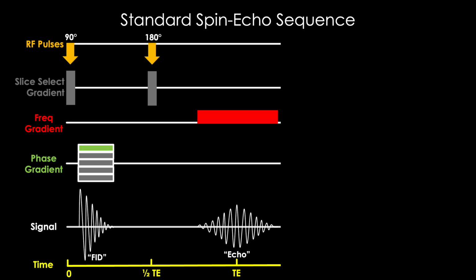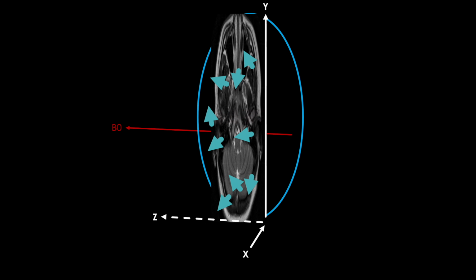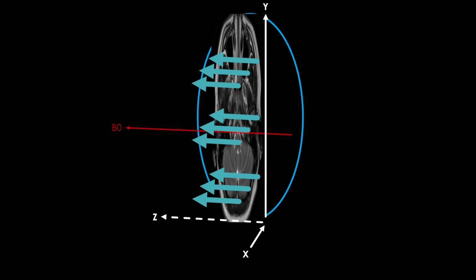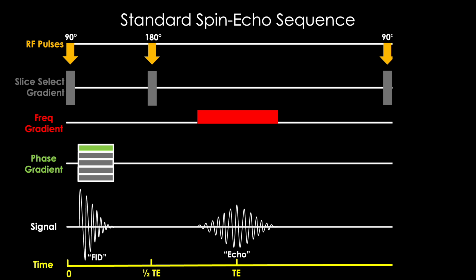And then we have to wait. Our spins are dephased, our net magnetization's gone, and we have to wait for these to realign and rebuild along our B0 z-axis so we can restart the process. Starting with another 90-degree pulse. A couple things to point out here.